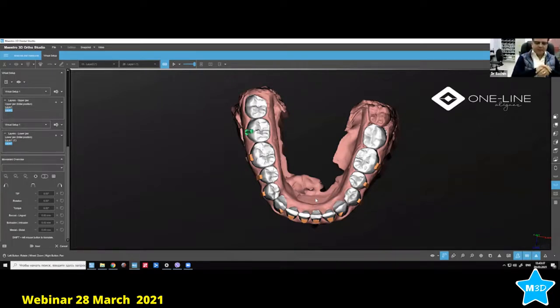So there is OrthoCaps from Germany. I think you know the doctor from OrthoCaps. Yes. She is using two or three kinds of thicknesses for the movements. She's using daytime aligners which are a little thinner, and nighttime which are thicker. And CA also, the clear aligner from Spain, is also using three kinds of sheets: the soft, medium, and hard.